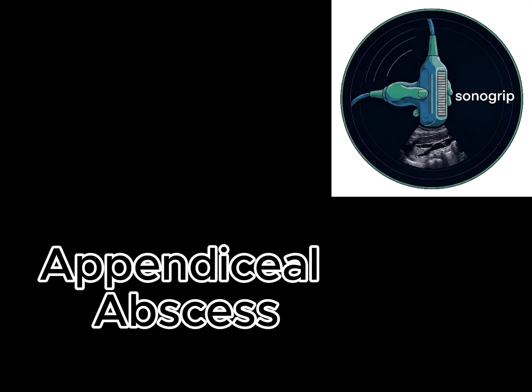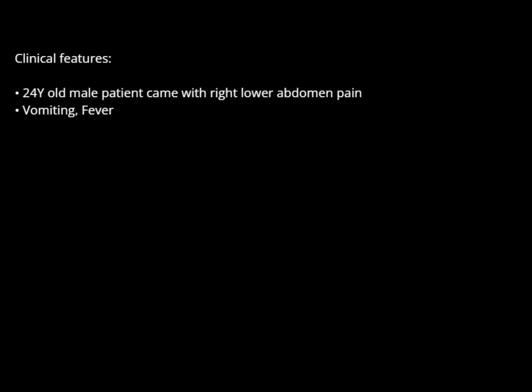Today we are looking at a right lower quadrant case study, which is appendiceal abscess. A 24-year-old male patient presents to the emergency department with acute worsening right lower pain accompanied by fever and vomiting. He also gave the history that 3 weeks ago he had severe pain in that area but somehow it went away, and now it has started again.